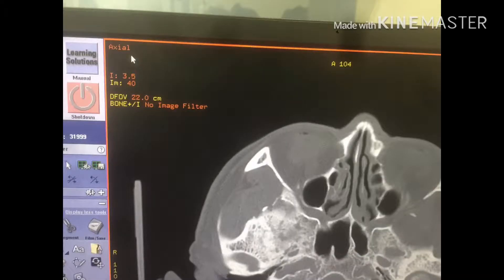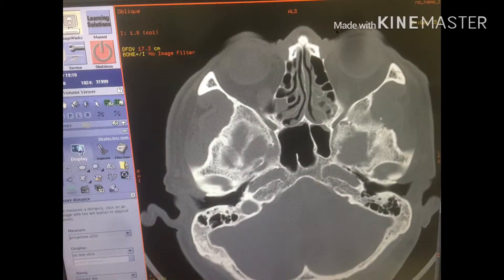This image shows you that the OML line is not yet correct. And right now, we show you how to adjust that OML line.